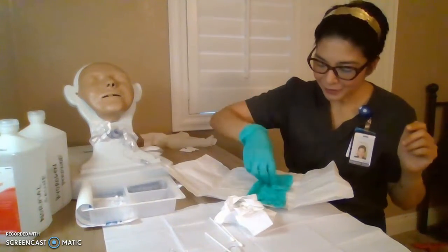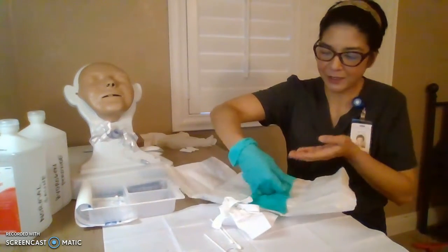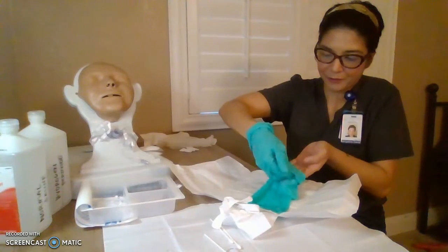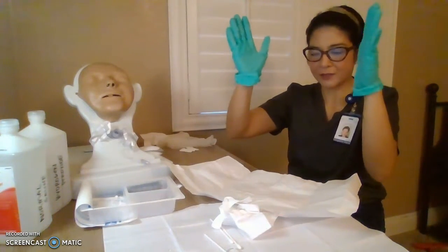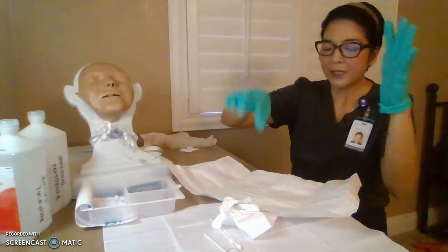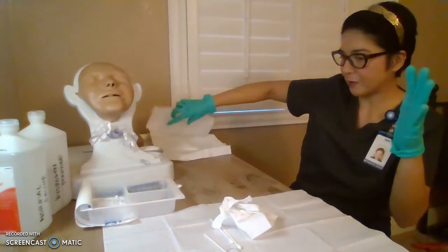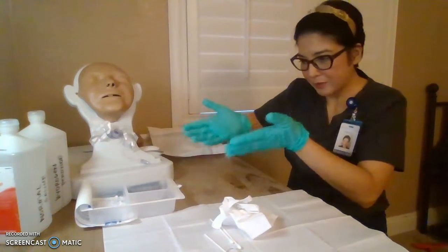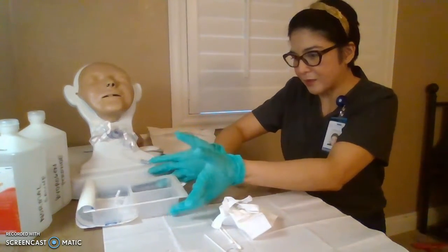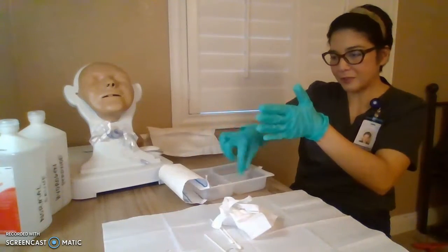And now this is sterile, so I can now put my hand at the outer side of the glove. All right. Making sure I'm still minding my field, not touching anything else. Okay. Keep your hands up. This is considered sterile, but we don't need that, so we can throw that away. Actually, technically, you can do this one since it's sterile inside.